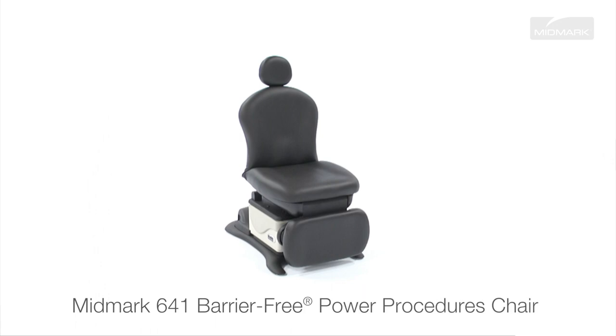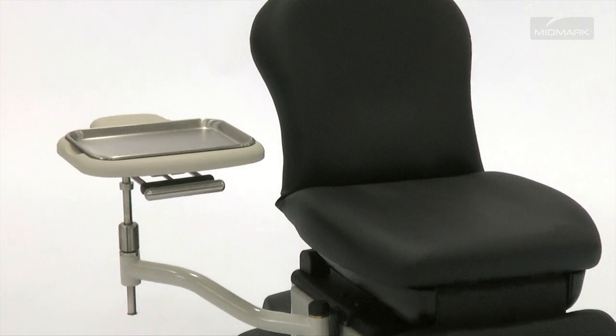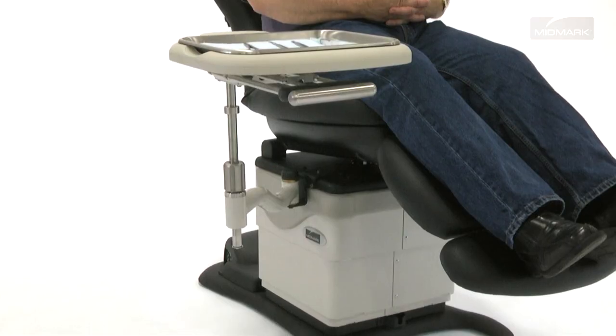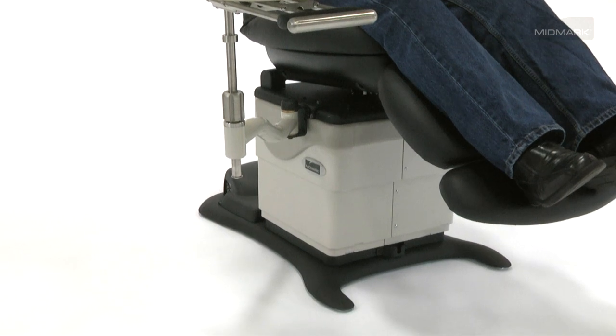The Midmark 641 Barrier-Free Power Procedures Chair is designed to be easily enhanced with a variety of accessories to fit your patient's and practice's specific needs. Available in two versions, the swingarm instrument trays are designed for placement of instruments and supplies within easy reach at the point of care, saving you precious time and freeing up valuable floor space that would normally be taken by Mayo stands.